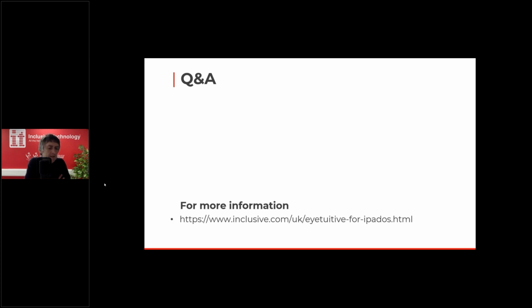Matthew asks, is Eyetuitive as good as Toby? Well, that's an interesting question. If there's a chance of trying these things, trying Eyetuitive, that's certainly something I would always recommend you do and seek out.